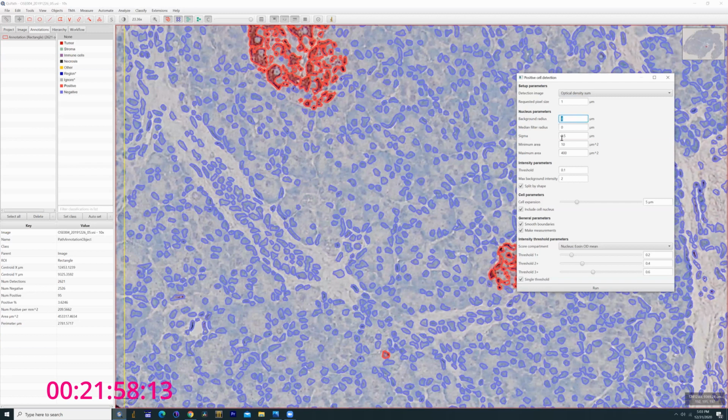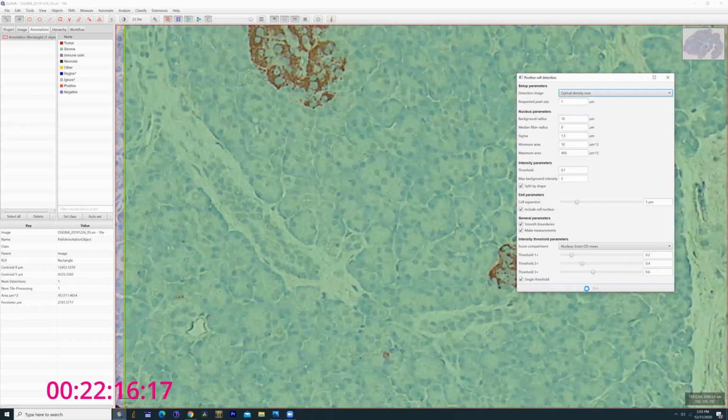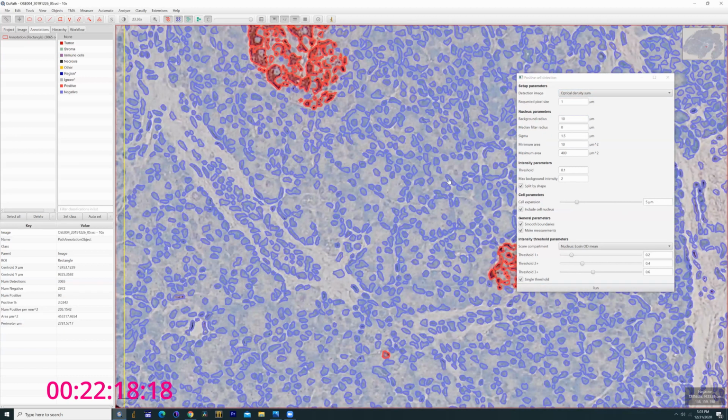What this does basically is the software is looking for the nuclei. It's then looking for the threshold measurement outside of that nuclei. So if you set this too low, basically it's just looking at the pixel next to the point of reference. As you set this higher, it's looking outside of this diameter for that reference. And so theoretically, you can see it's actually expanding out.